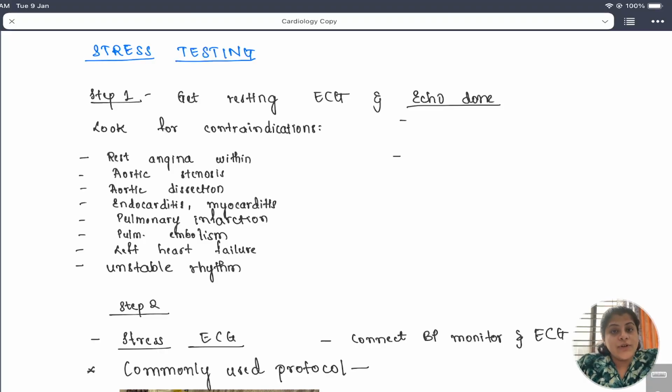In my previous video, we learnt about the pathogenesis of chronic stable angina, investigations, and the main symptoms of chronic stable angina. In this video, we will learn about stress testing.